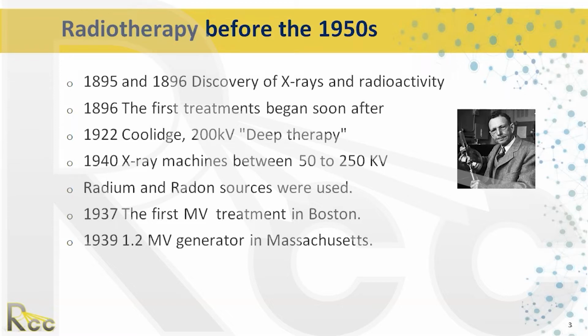And finally, to begin the end of the X-ray tube orthovoltage range and the beginning of Cobalt, in the interim, we have Van de Graaff generators, which were used in and around Boston. I actually had the opportunity to work on a Van de Graaff generator early on in my training. And these were used for the production of high energy X-ray.